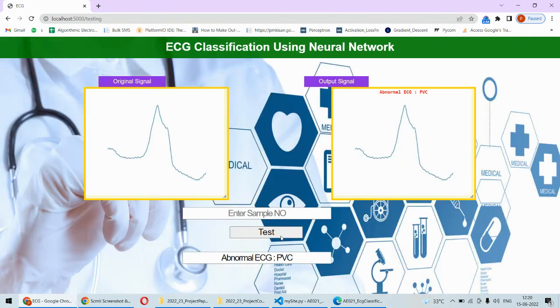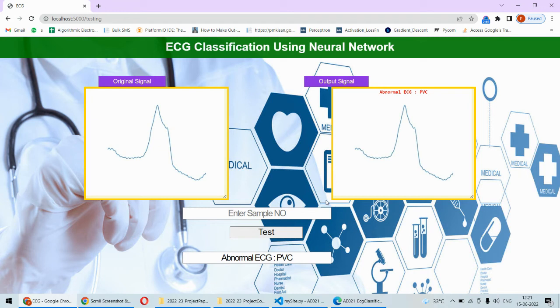Now it's PVC ECG. So total we are having 1800 samples of the ECG signal which is classified in three different categories: normal, PVC, and the fusion ECG which detects the abnormalities in the EC signal.